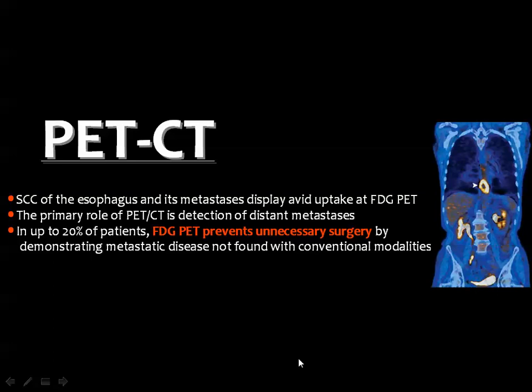Of course, the esophageal cancer and its metastases will show uptake by the PET-CT, and this is one of the values of PET-CT. In such cases, it can or may prevent unnecessary surgery by detecting metastases that were not seen with conventional imaging modalities.